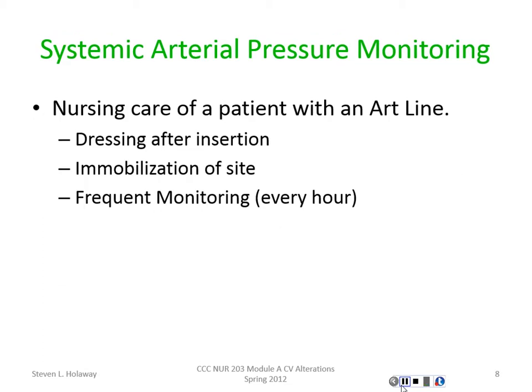Your care, basically, again, you're not going to be putting these arterial lines in. You're going to be setting up the system before they put the art line in. You're going to be maintaining that art line after it's put in, and you're going to be monitoring it.